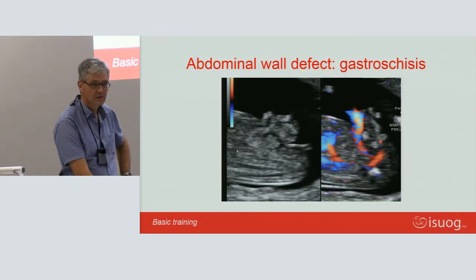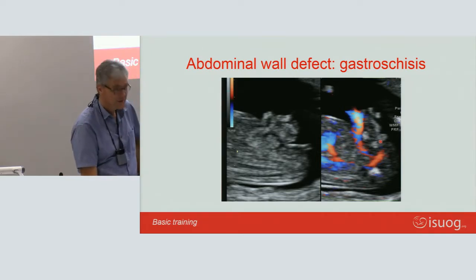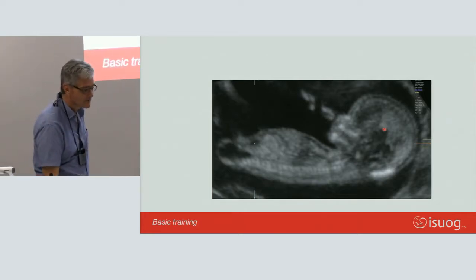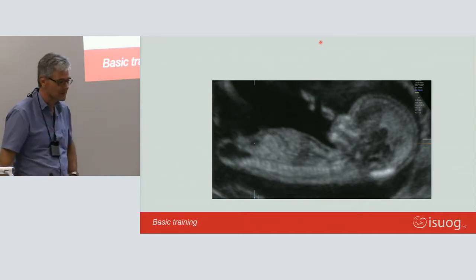And okay, this gets more tricky. You really have to be alert. There's no such thing as a free lunch, eh? So you have to work for it. And let me just take the marker out of the way, so that you don't think the problem is where the marker is. So what does this baby have?